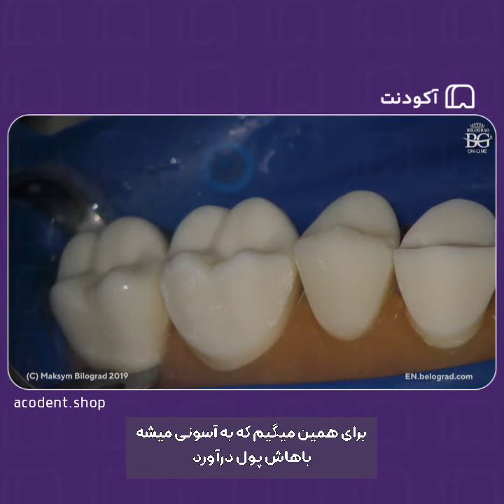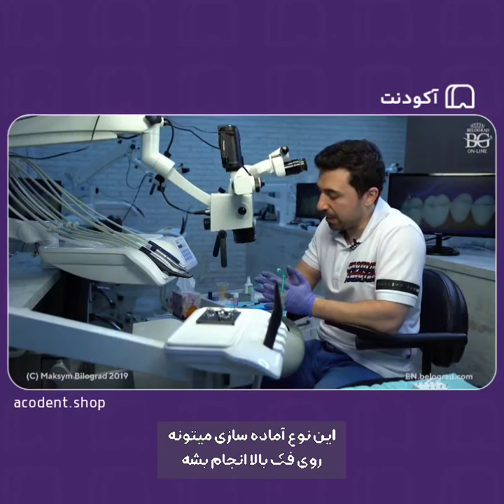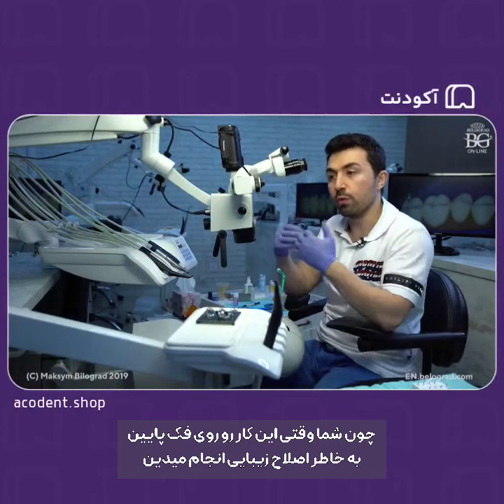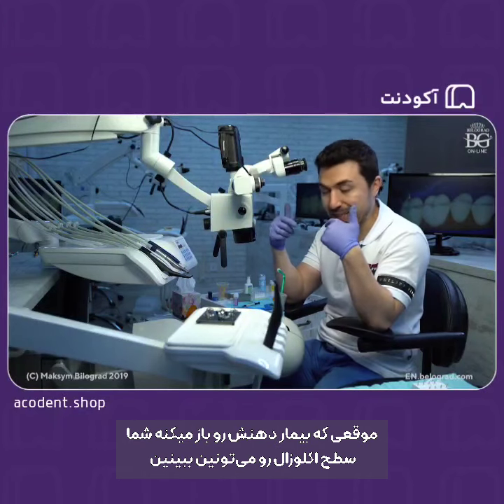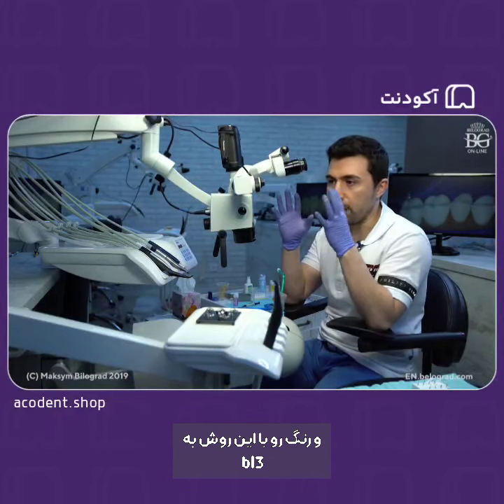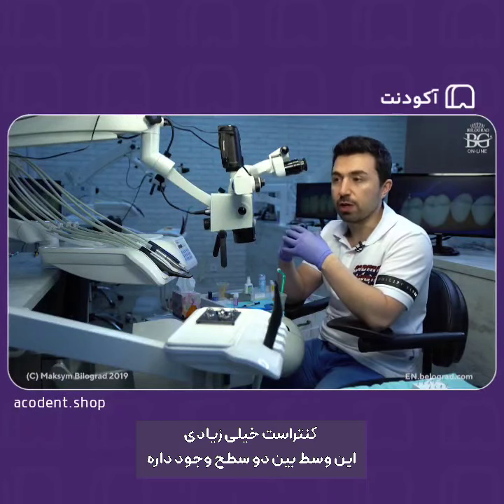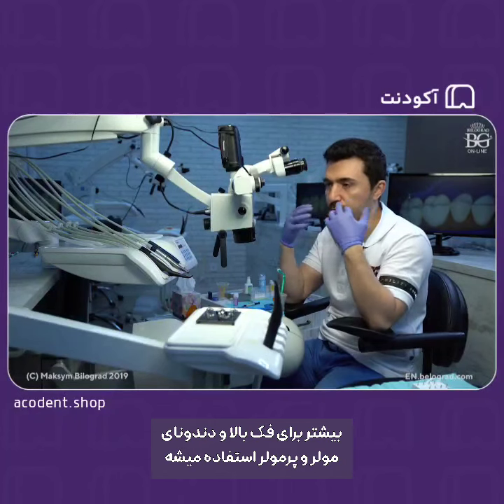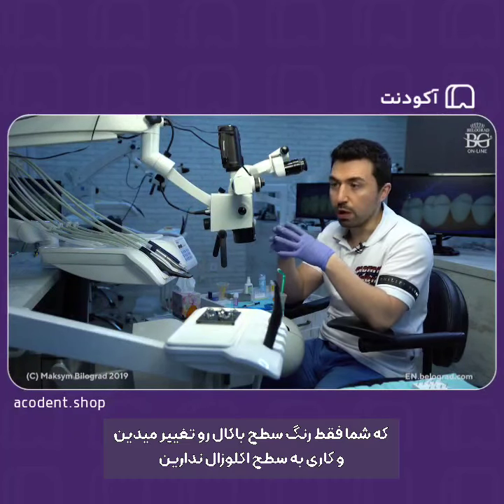Okay, that's why we call these easy money cases. You just need to change the color, and basically these kinds of preparations can be done on the upper jaw, because when you do a lower jaw aesthetic makeover, when the patient opens the mouth, you can see the occlusal surface, and just imagine if you have a tooth of A4 color and you are doing BL3 for example, and you will see this occlusal surface, which is a pretty big contrast. So window prep is more for the upper jaw, for molar teeth, for premolar teeth, when you change the color but you are not doing anything from an occlusal perspective.